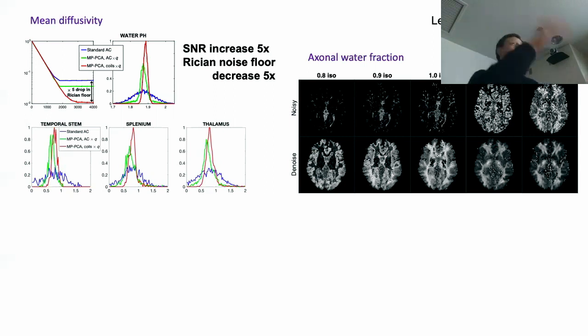No. We then take a magnitude. We do the fits on the magnitude images. That's not the point. The point is to do the PCA with all the diffusion measurements combined, not on every image separately. But then what's the typical SNR that you operate on?